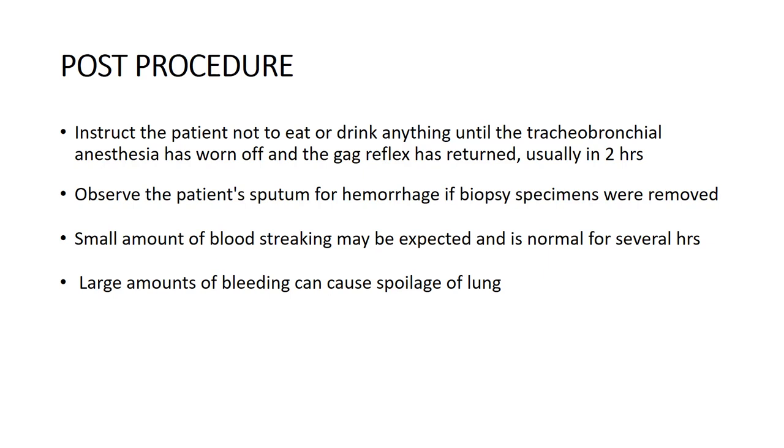Bronchoalveolar lavage fluid is collected into a mucus trap or mucus extractor. It is important that you connect this chamber only when the bronchoscope is in the trachea and you are going down towards the bronchi. We should not connect this mucus extractor beforehand, because when you are going through the nose and pharynx, you may end up collecting the secretions from the mouth itself. So the collection chamber must be connected when you are in the airway, in the trachea, not before. And the same collection chamber, the mucus extractor, should be disconnected before you start coming out. That's a very important step, especially when you are collecting a sample for microbiological studies in infections.